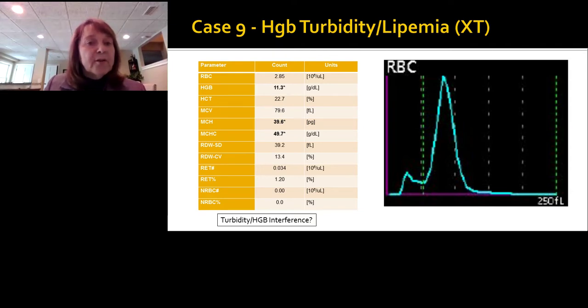Also important for you to look and check whether the hemoglobin and hematocrit match. If we remember the match, hemoglobin multiplied by 3 should approximately equal your hematocrit. We can see if we multiply this one, 11 by 3, it would give us a hematocrit of about 33.